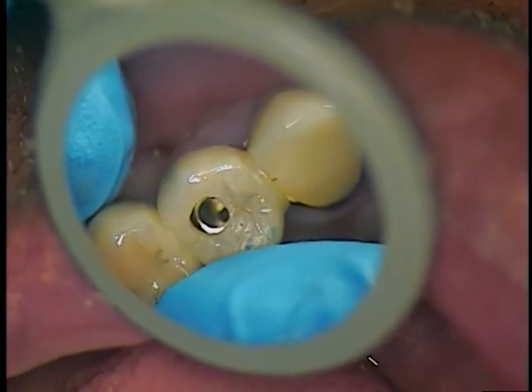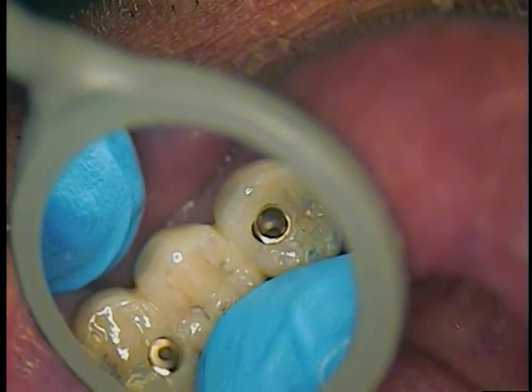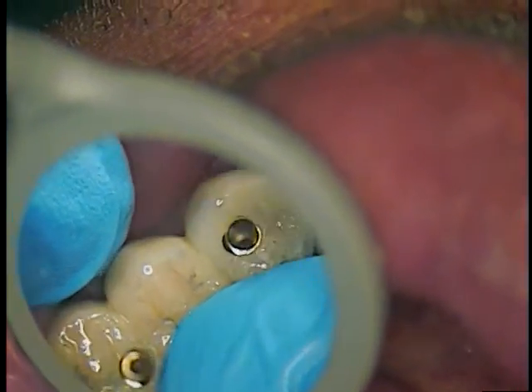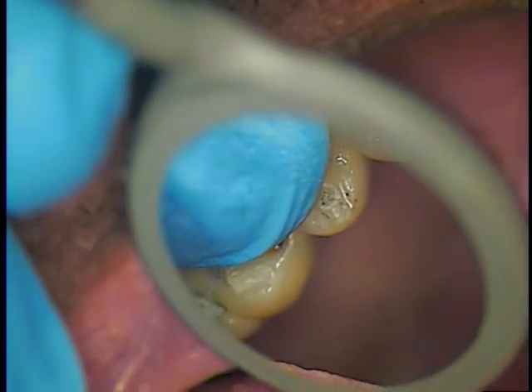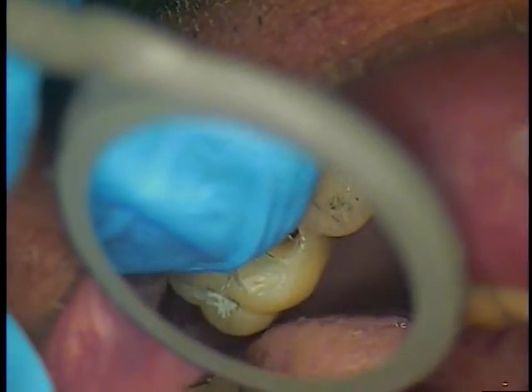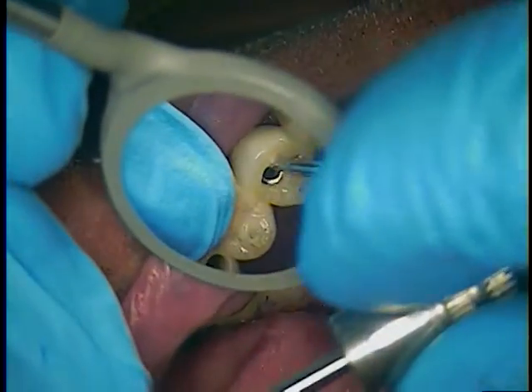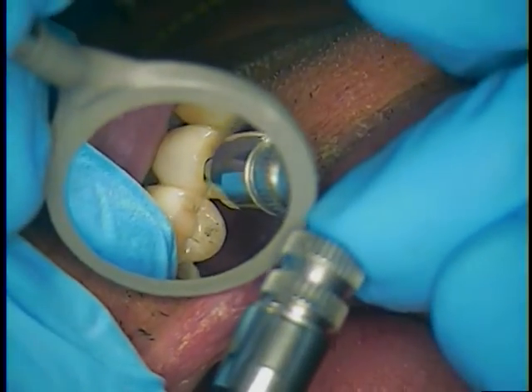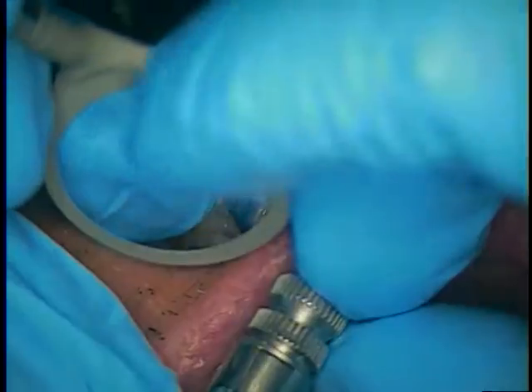Now everything is aligned properly. You can see the screw holes are all ready to go and aligned properly. The next step is to take your driver — you don't tighten, but you just want to try and see how the driver fits and do a trial driver check. We take the driver, go in and find the screw because you're going to be simulating. Have him open up just a little bit. Now that bottoms out nicely. Take the other one, go in there — and that's also perfect.